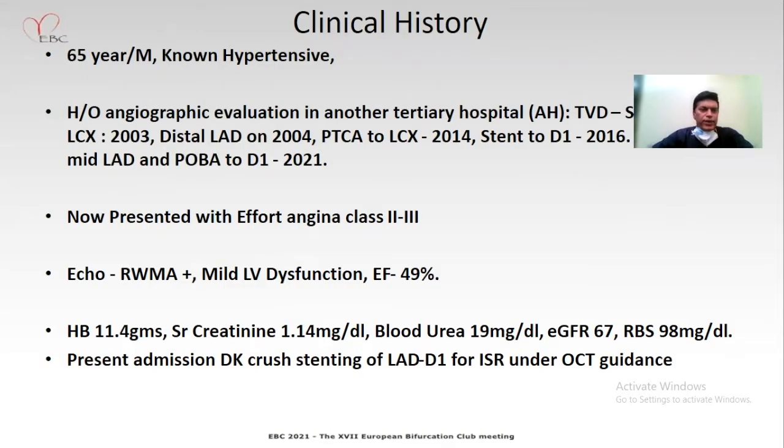This is a 65-year-old gentleman, known hypertensive. He underwent multiple interventions. Presently, he got admitted for PCI of ISR of the LAD-D1 bifurcation site under OCT guidance.